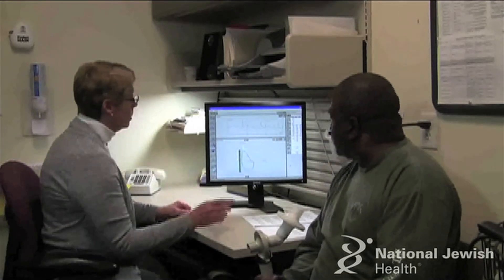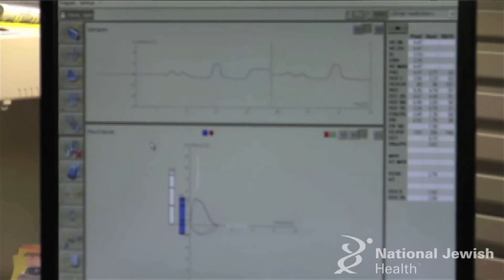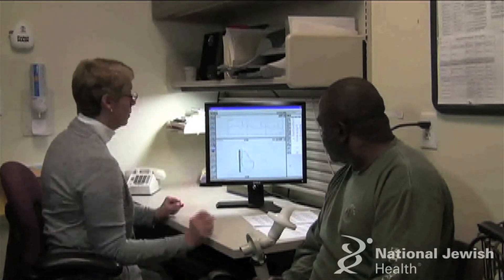I want to show you what your efforts look like on paper. This is your big breath in and this is your big breath out. And as you keep blowing it comes down and makes this curve. Good job.